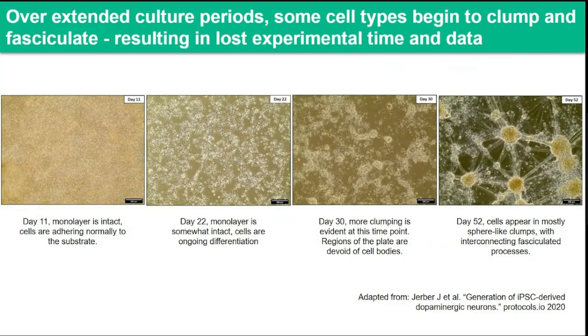So let's look at this example figure, the differentiation of iPSC-derived dopaminergic neurons over 52 days. On day 11, this is a normal and intact monolayer. On day 22, differentiation is progressing. You can see the neurites forming, and the monolayer is still mostly intact. At day 30, we see clumping emerging, and regions of the plate are now devoid of cells. And by day 52, the cells appear almost entirely as spherical clumps connected by fasciculated processes. So this is an actual differentiation protocol, and it illustrates exactly what long-term detachment looks like in practice.